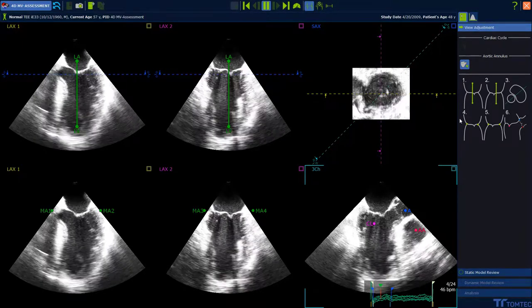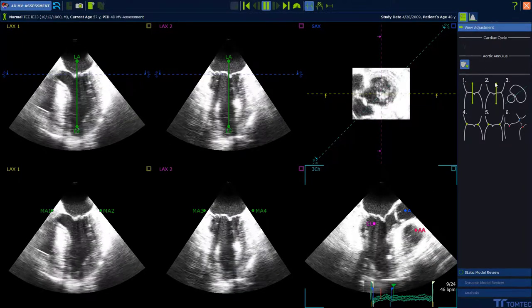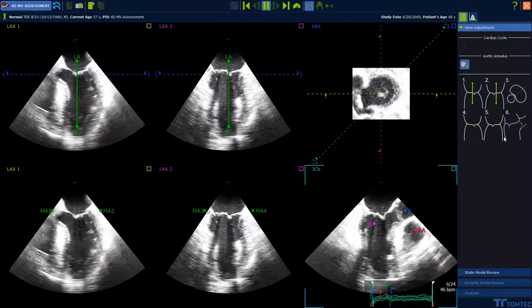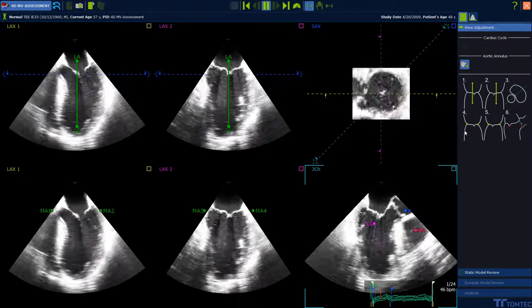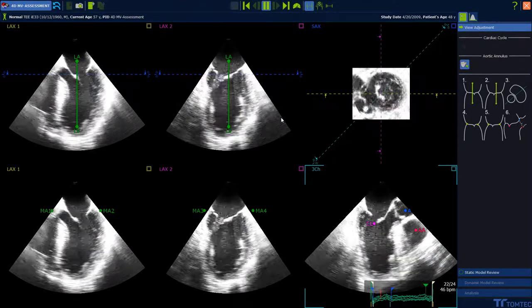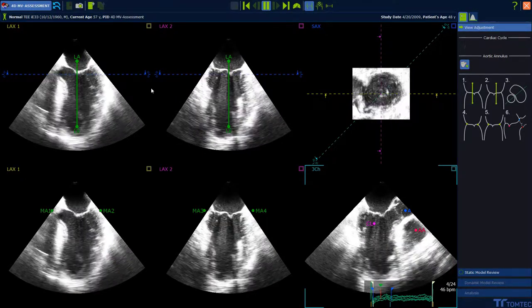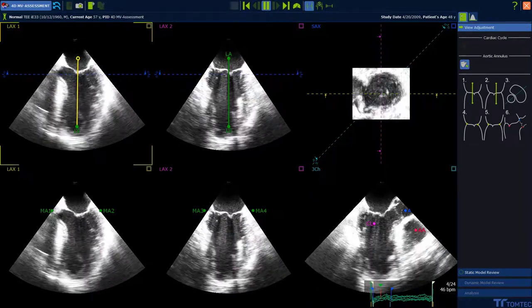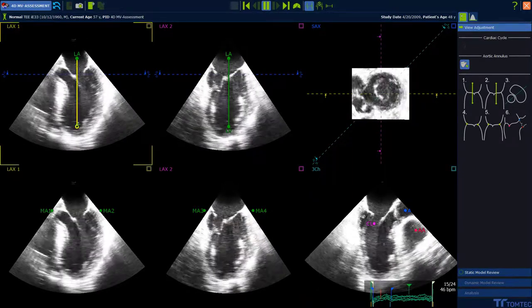Use the helping guide on the right side to place the landmarks. Just note the sequence of images. Reposition the landmarks if necessary by drag and drop.